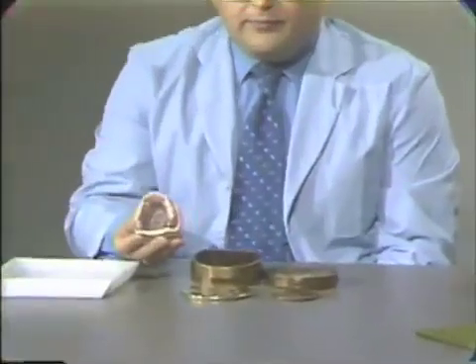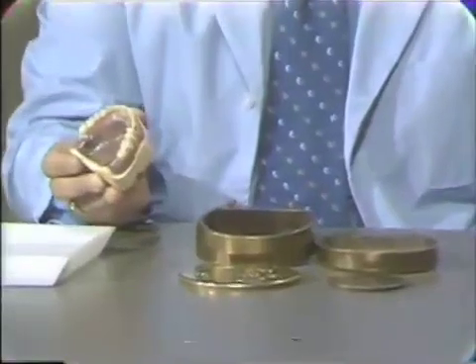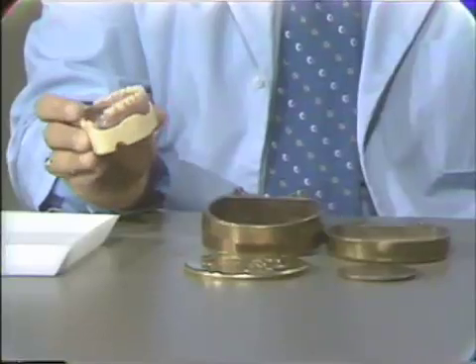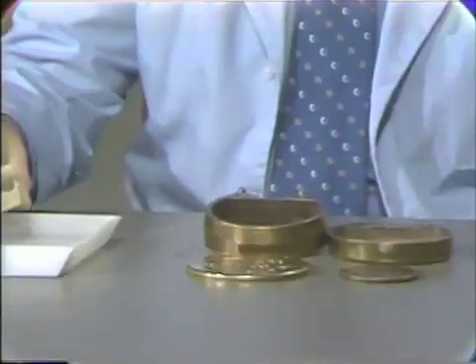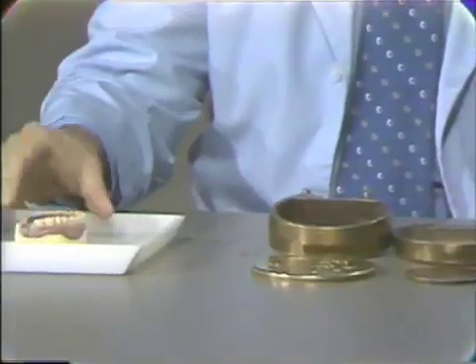At this point, you all have completed setting the denture teeth and completing the wax up. Prior to flasking the denture, you should remove the master cast from the mounting, as you see here. This is simply placed in water so that your master cast is thoroughly wet prior to flasking.